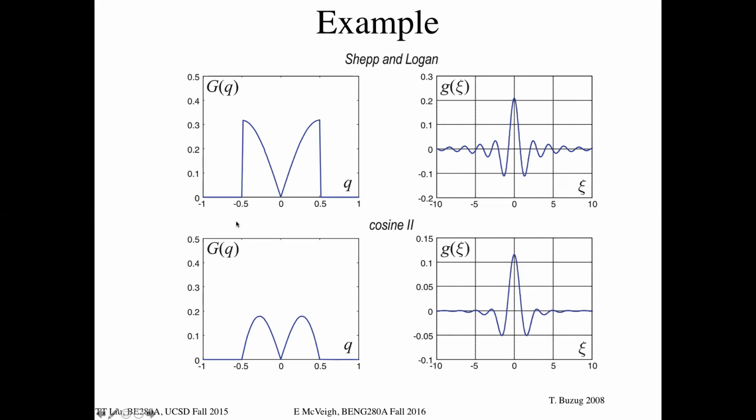Classically, the way to look at this is it's a filter, a kernel. And this is done a lot in nuclear medicine, where these high frequencies, as we saw in that slide very early on, are suppressed, and it makes a picture that's easier to look at.